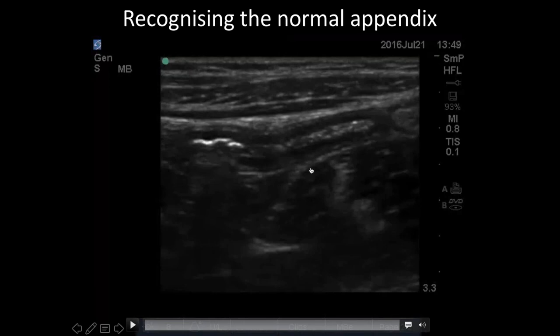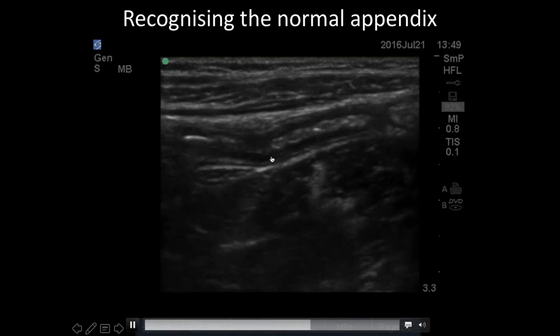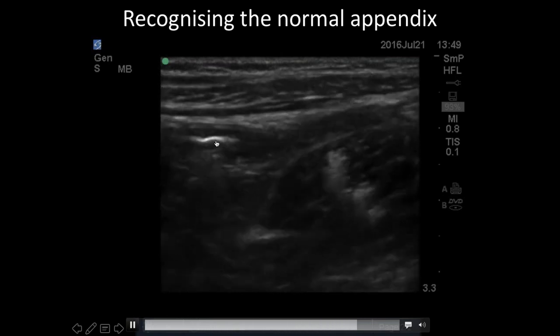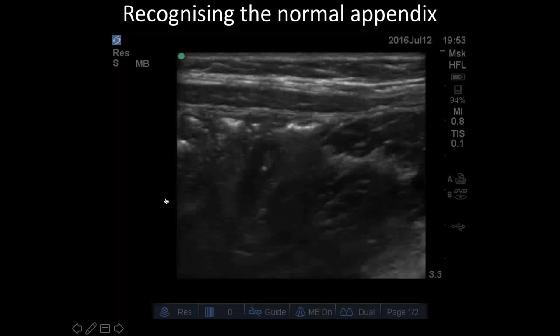This is the psoas muscle right underneath the appendix, and again, abdominal wall right up there. So pay attention to this finger-like projection in long axis. As we were playing that, you'll notice there's a bright white line here too, and that's actually air trapped in that appendix as it comes off the cecum, and you can see some dirty shadowing as well.